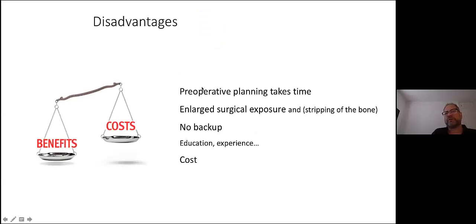And of course, there are some downsides also. The preoperative planning takes time. So altogether, I think now if I do a fracture like this, I say maybe 30-40 minutes in the operating room, but I lose that maybe when I do the planning.